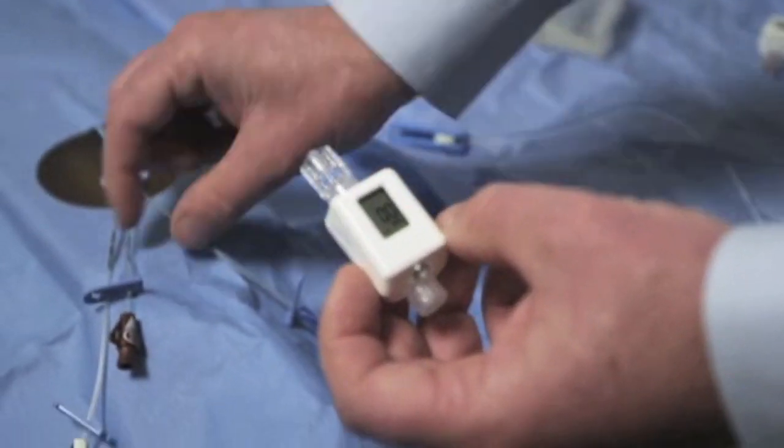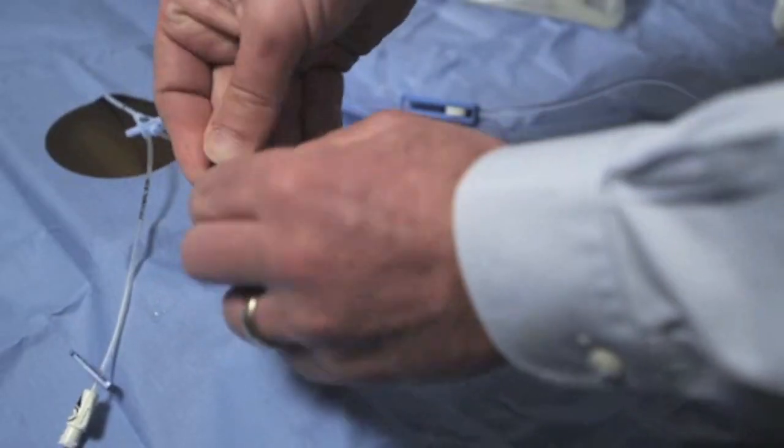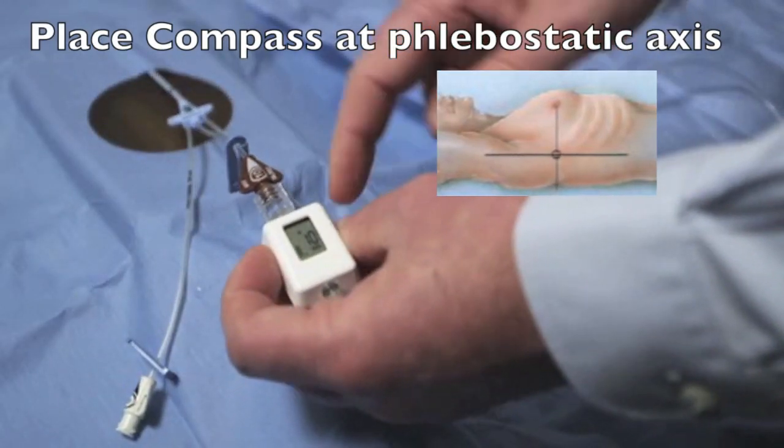It can be attached to the distal lumen of the central venous cap, making sure to secure the device to the port with a lock. The device will then display the patient's central venous pressure.